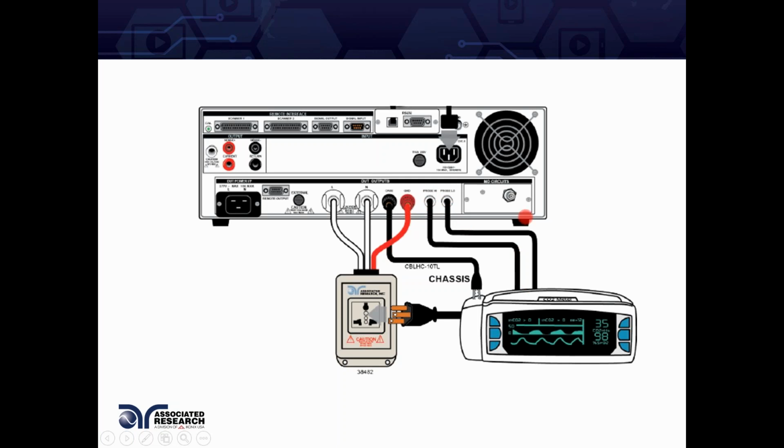As you will see later when I go through the MedTest app note, depending on what kind of applied part you have, and depending on if you're just doing a simple earth leakage, you may not be required to have this probe high, probe low setup on your product. So this device, internally or externally using a power supply, will power up your product. What we're trying to measure is what would happen if your product is running in a normal condition, powered on at full operating temperature, operating condition, while it's doing all these measurements. How much leakage can you feel on the chassis of your product?